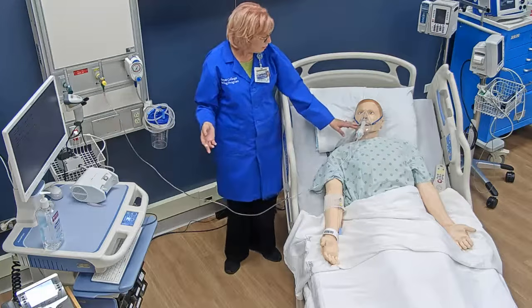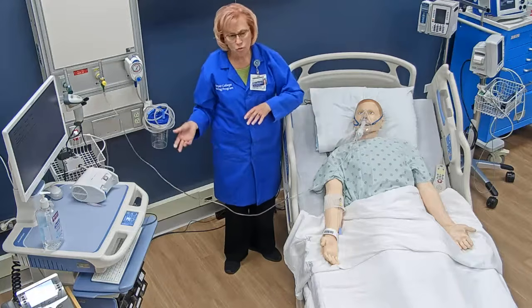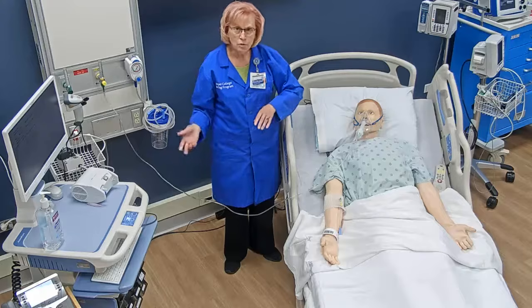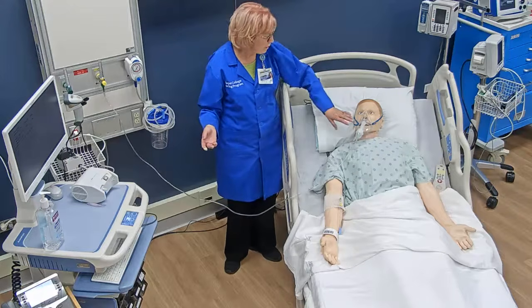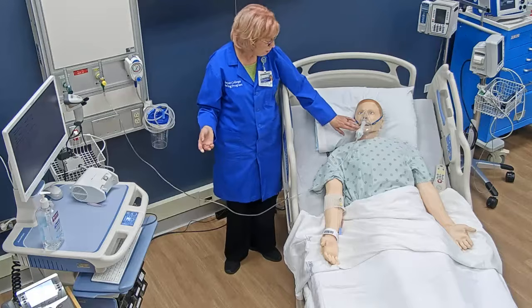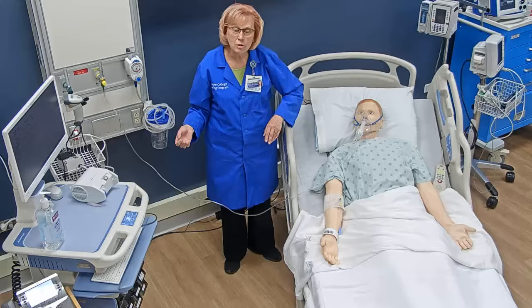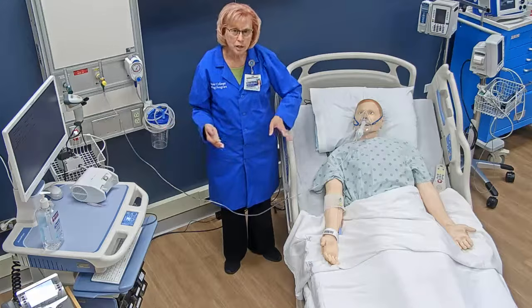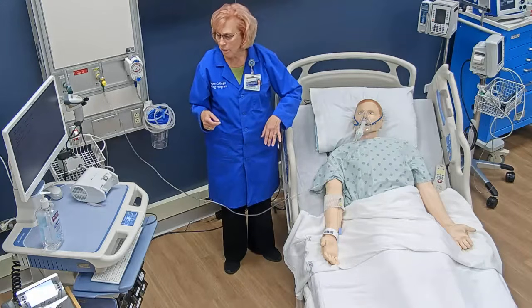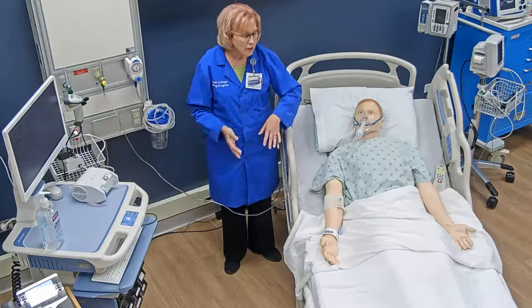Once this is all completed, you can remove the mask, and you can store it away, and it's ready to be used again for the next time. The mask can be reused as many times as you need to in order to give the medication. Make sure that you assess your patient before giving the medicine and also after giving the medicine, and document any changes. And that's all for administering.